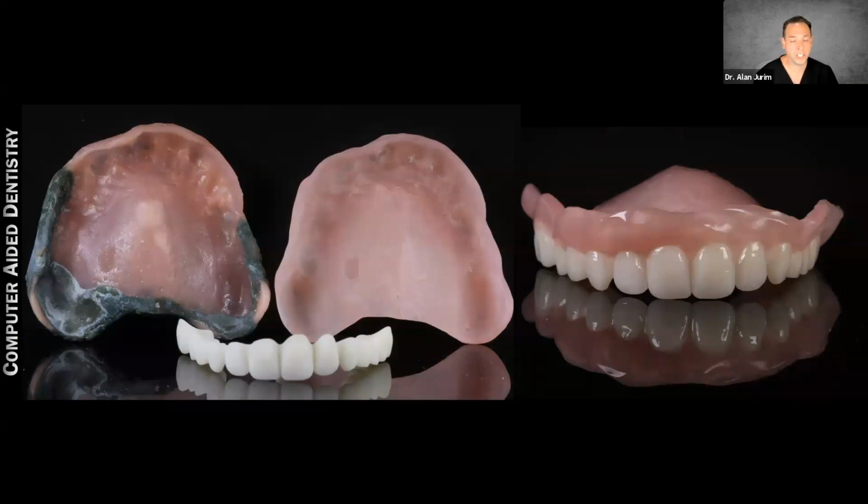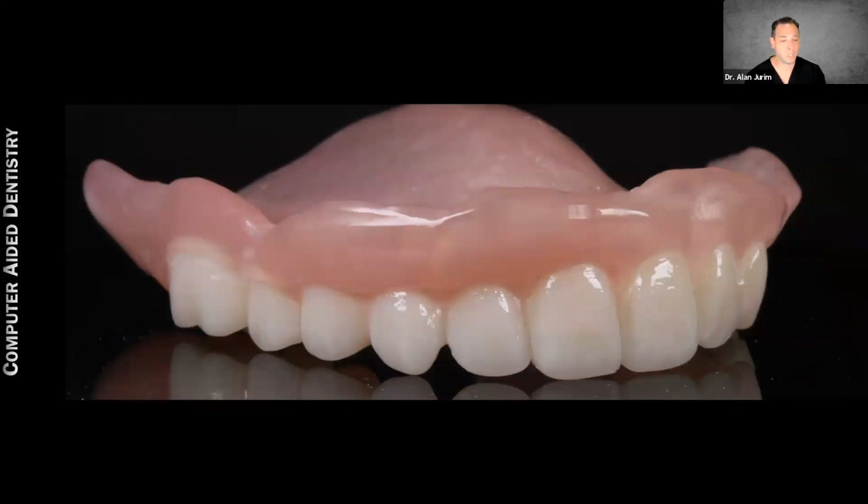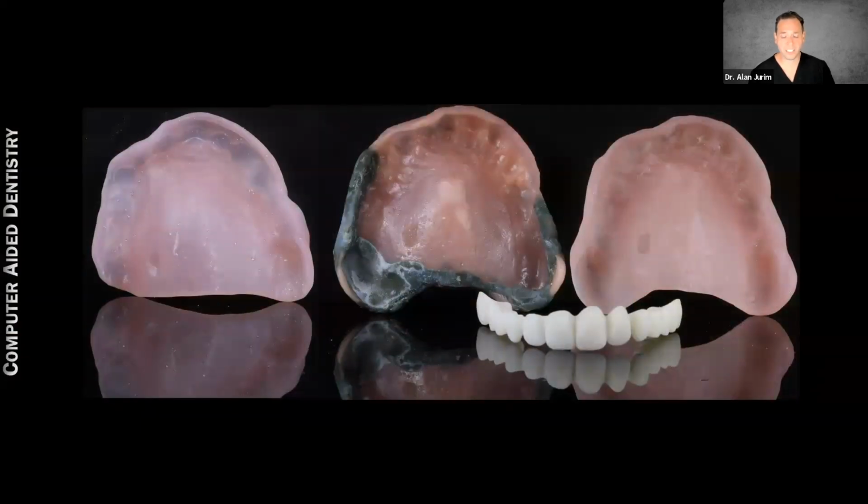This is something which I did a couple months ago, and what I really like about it is, again, the 3D printing solution means that we now can produce a denture for a patient that has much better results for that immediate form and fit. There's less post-operative adjustments, and of course, it's very easy for us to reproduce if that's the case. So the patient's very happy, and I think I saw them for maybe one post-operative adjustment, just for the occlusion. So really great solutions, and there are so many different parts that we can use the printer for, and for me, it's the most exciting part of clinical dentistry these days.